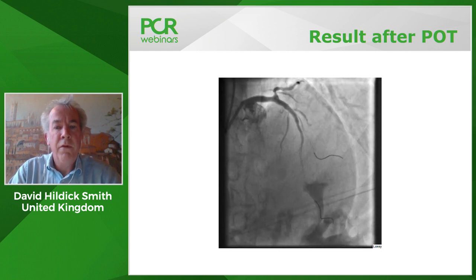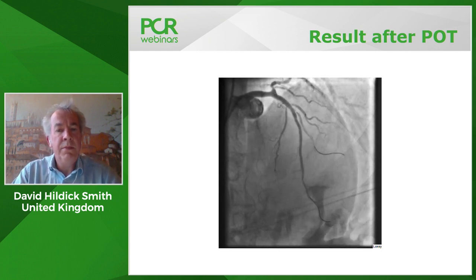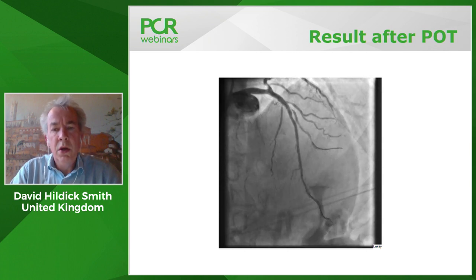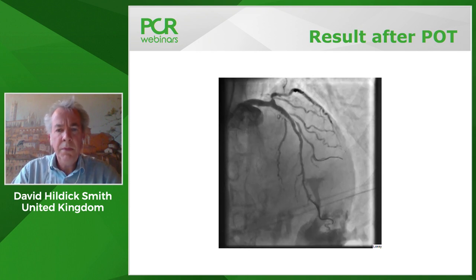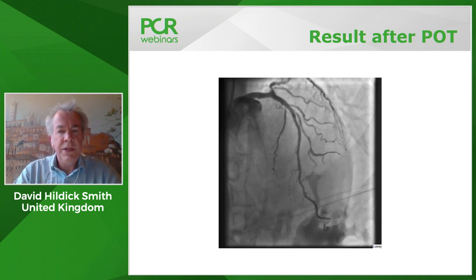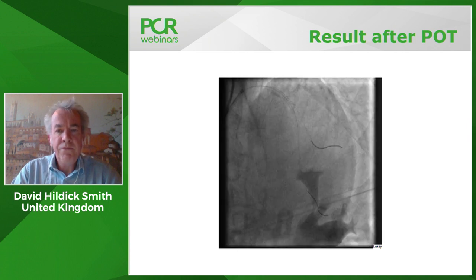So now we have, again, a similar result, a very tightly pinched ostium of the second diagonal, but good flow. So this is then the point at which we rewire.